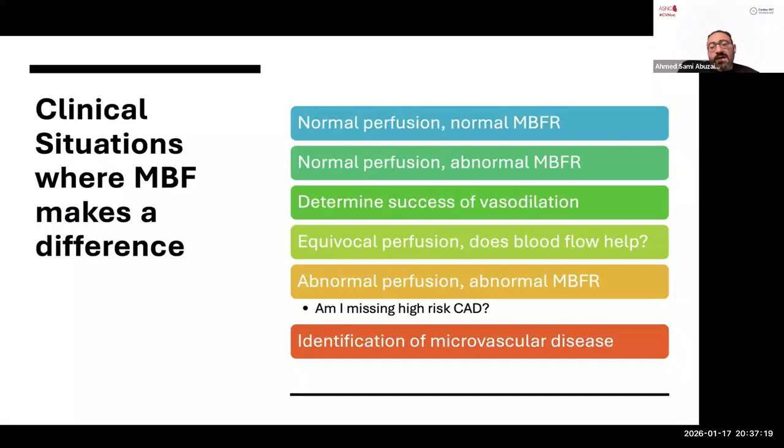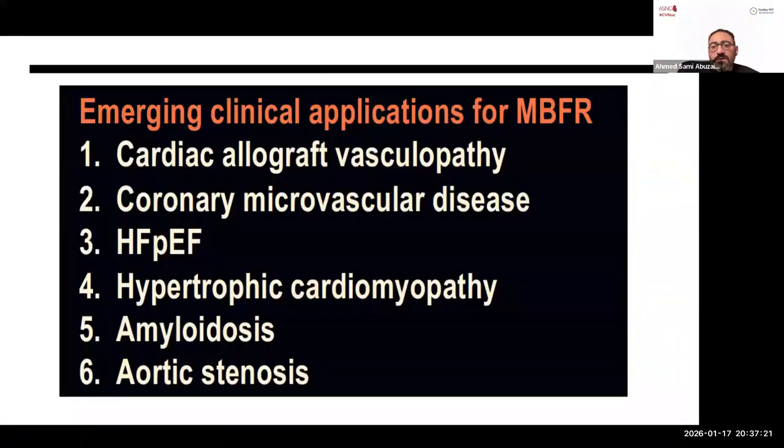So I think myocardial blood flow adds a lot to our stress testing in cardiac PET. And there's an emerging application in transplant, where I think microvascular ischemia is very important, and in HFpEF, heart failure with preserved ejection fraction.